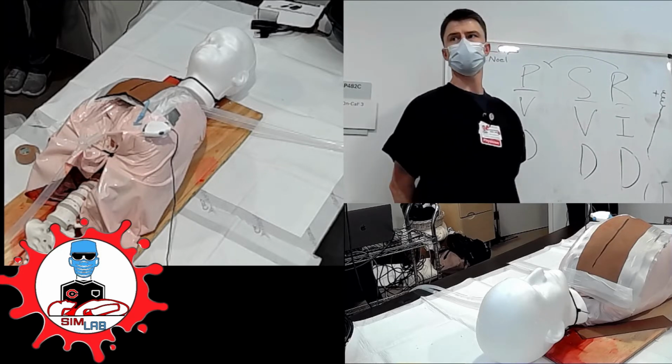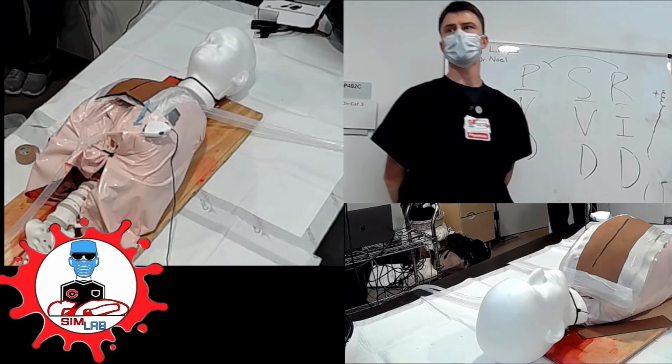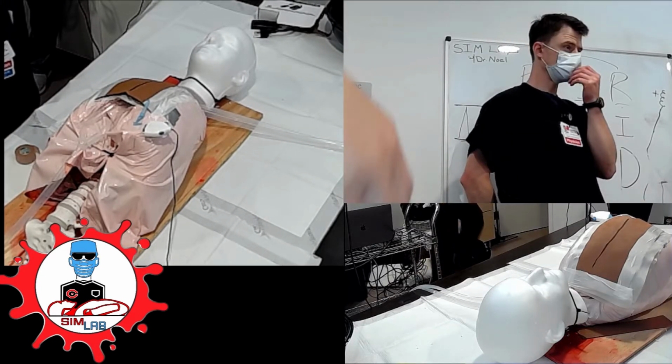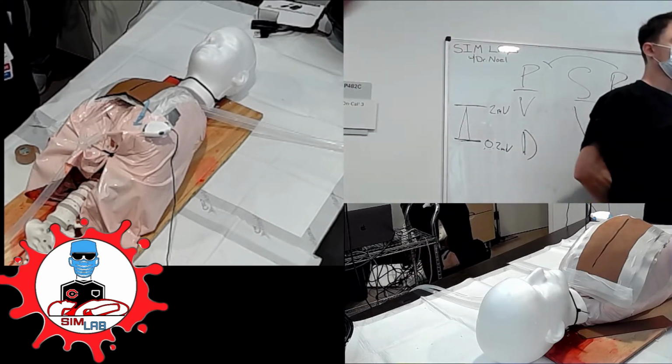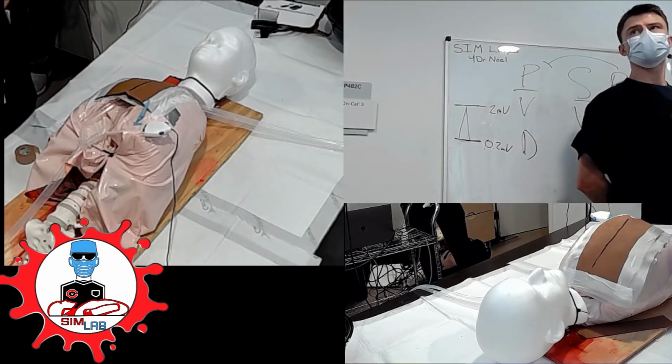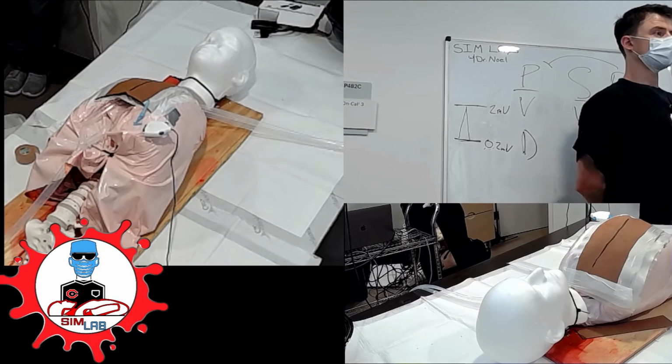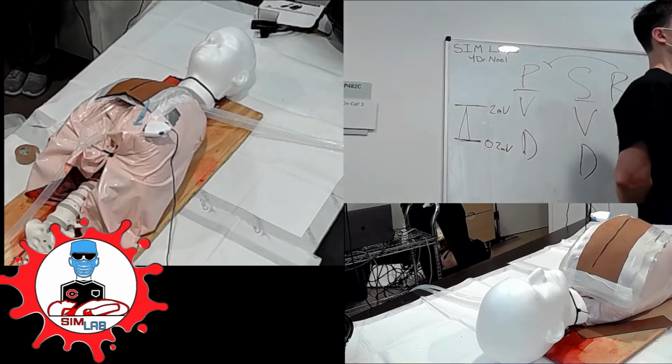The reason why, if you're just plugging in the ventricular side, is that sometimes these connectors are reused, or sometimes they're brand new, and one side works better than the other. I didn't put them together. I can't explain it, but that's why we swap polarity, because sometimes it just works, and in these situations you just don't argue when it works. That makes sense. Same thing with grounding.